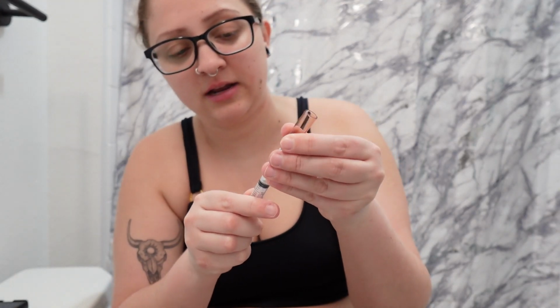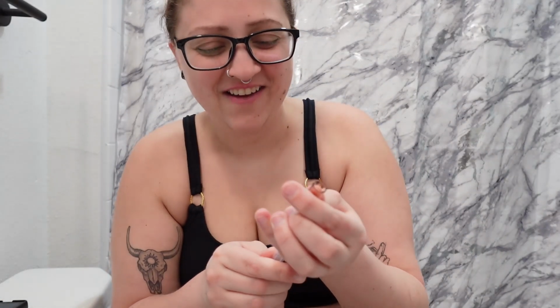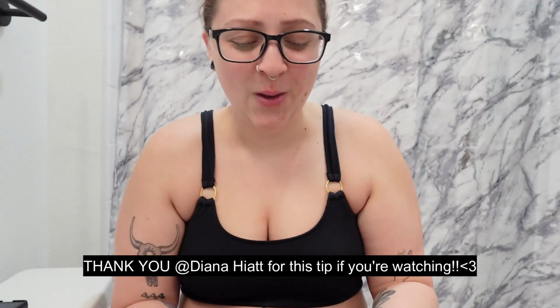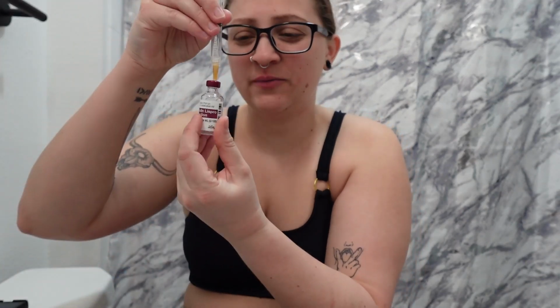Anyway, all right, so we're gonna go ahead and just take out the air from, oh my God. We're gonna go ahead and take out the air from the cartridge. And this was a tip that was commented on the last one. So thank you for that tip because I genuinely forgot. And then we're gonna put about 180 units of air into my insulin Lispro. And then flip it around. And let's see if we can get what we need out of this vial.